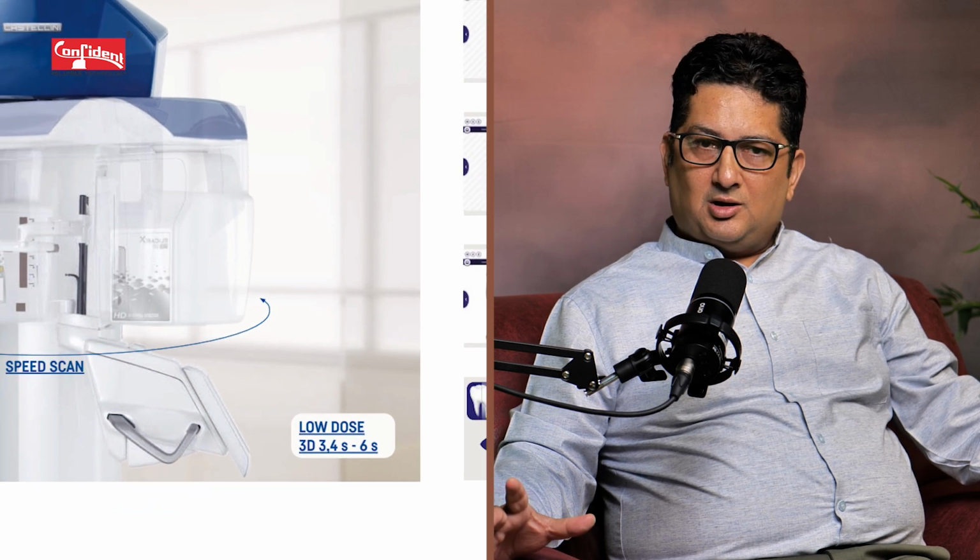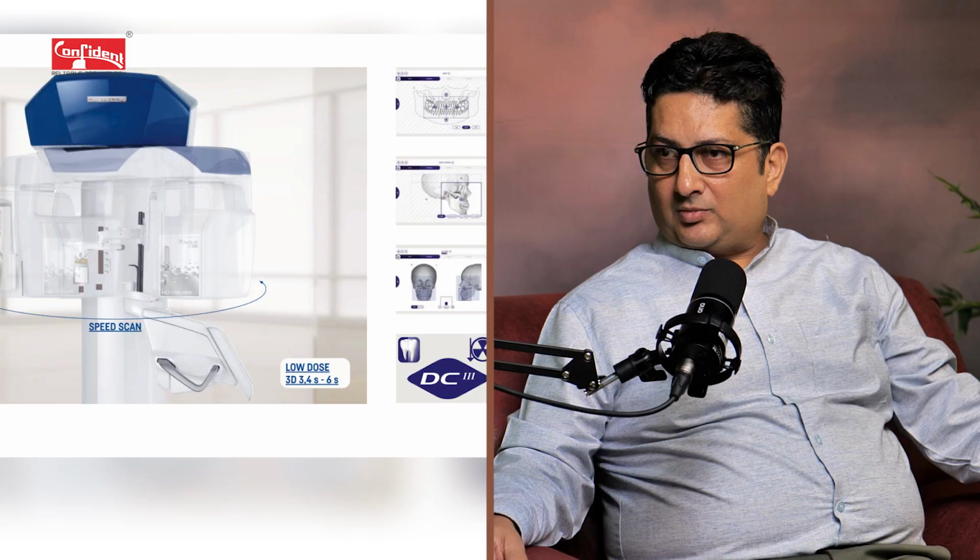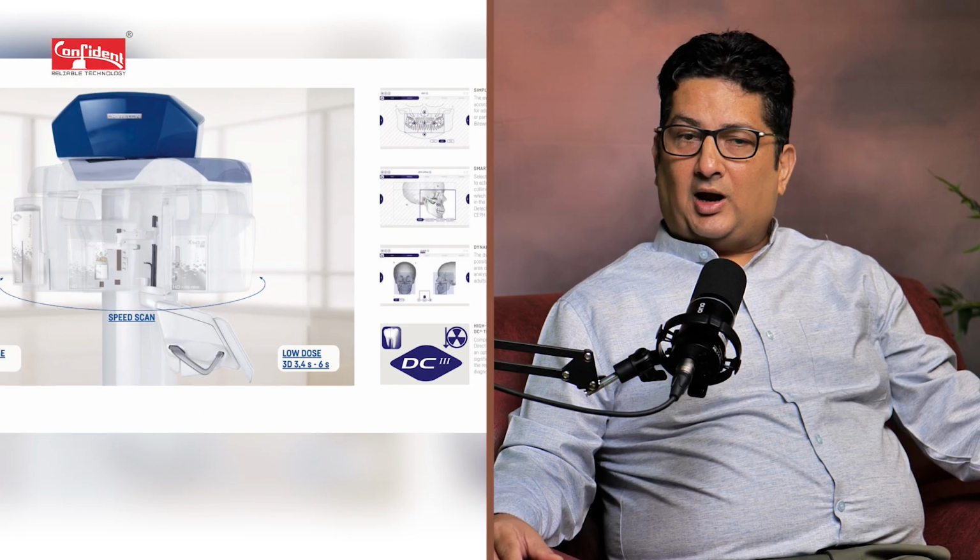So it makes sense to go for a device which has these modes of low resolution, pediatric resolution and high resolution. So we can actually control the amount of radiation depending upon the bone density of the patient, because we believe in the as low as reasonably achievable, ALARA, principle. So thank you for highlighting that, sir.